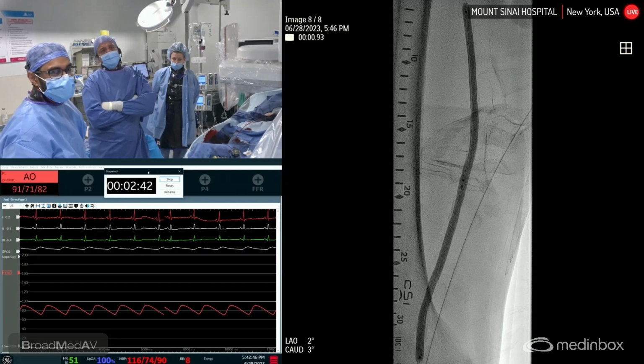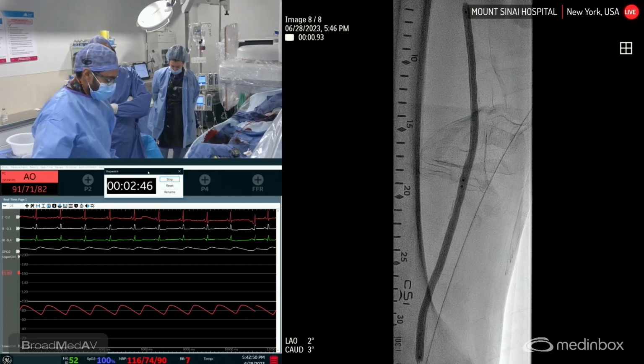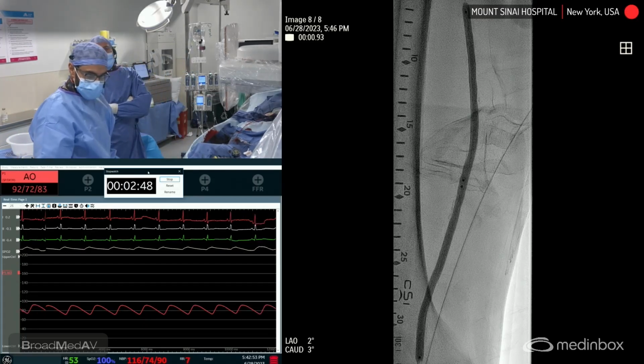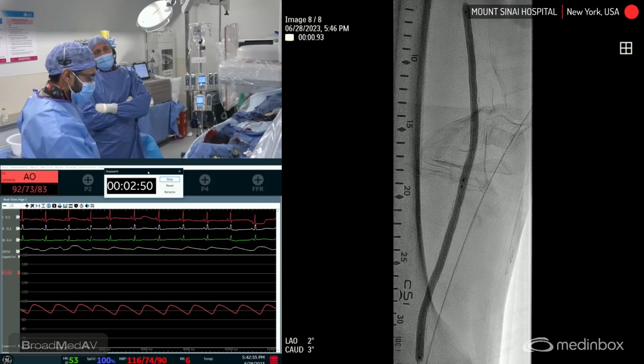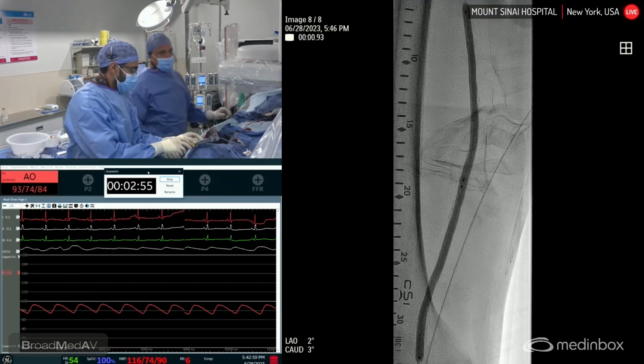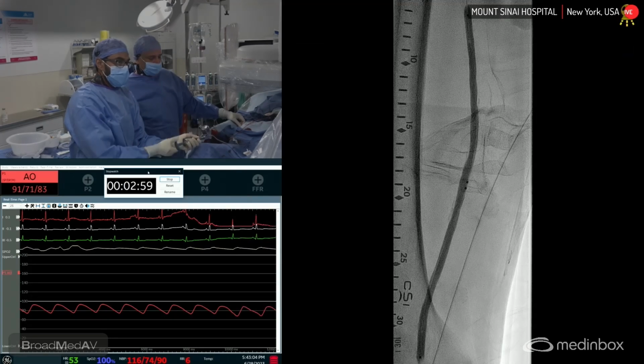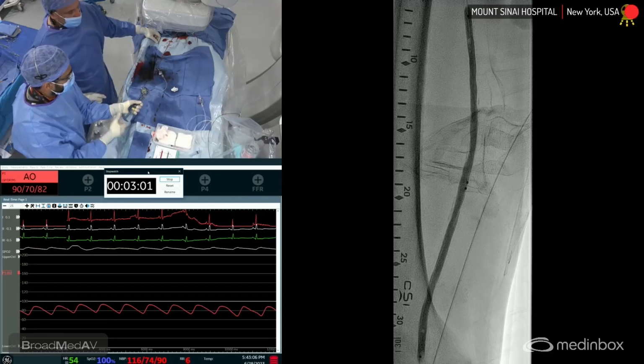Probably a 5.5, yeah. 6.0 Dorado or something. This is the stuff you pulled out. All right, down. So we're going to let it come down at 3 minutes. Probably going to have to go double negative twice.